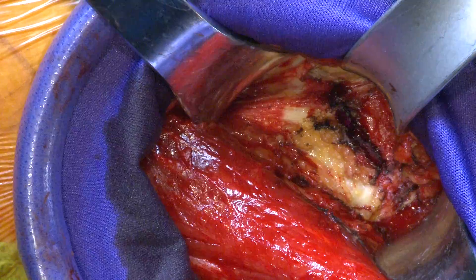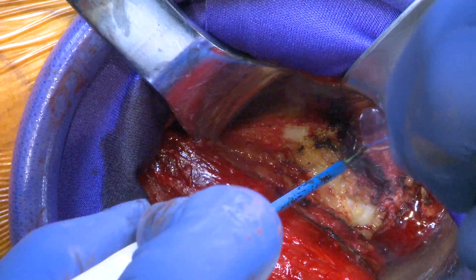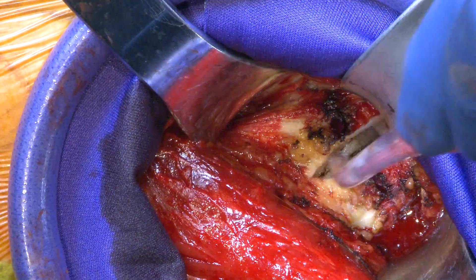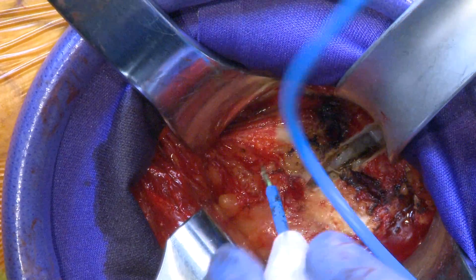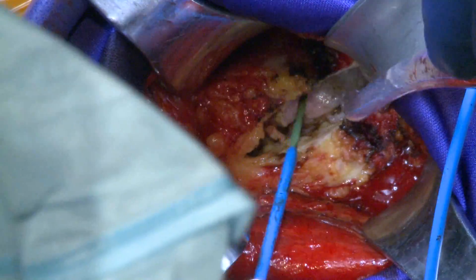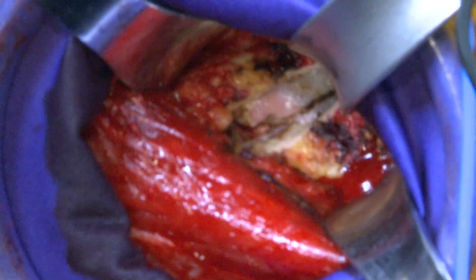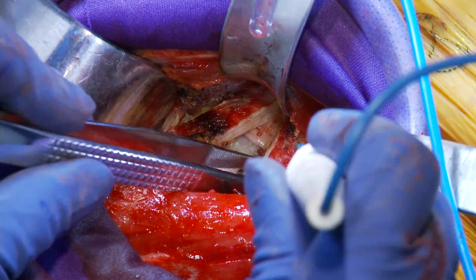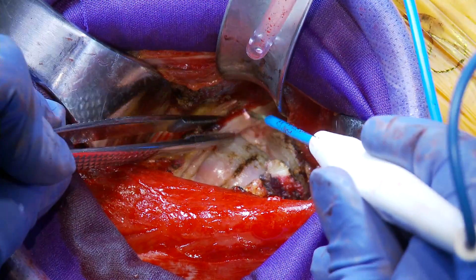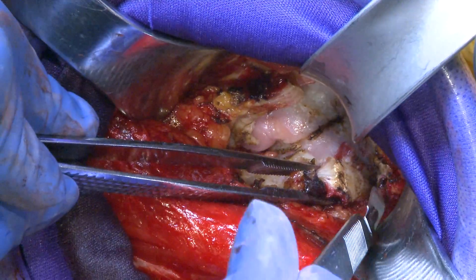We have a pretty good shot at our capsule right there. I'm going to cut along the femoral neck all the way from the acetabulum down — you'll see joint fluid coming out now. The idea is to cut the capsule longitudinally from the acetabulum to the intertrochanteric ridge. There are many different ways to cut the capsule, but this is what works well for me. Now you can see we've opened up — you can see the femoral head and the acetabulum.